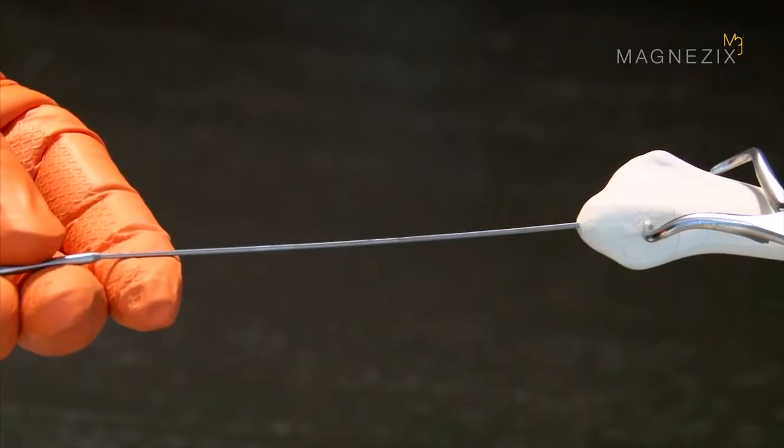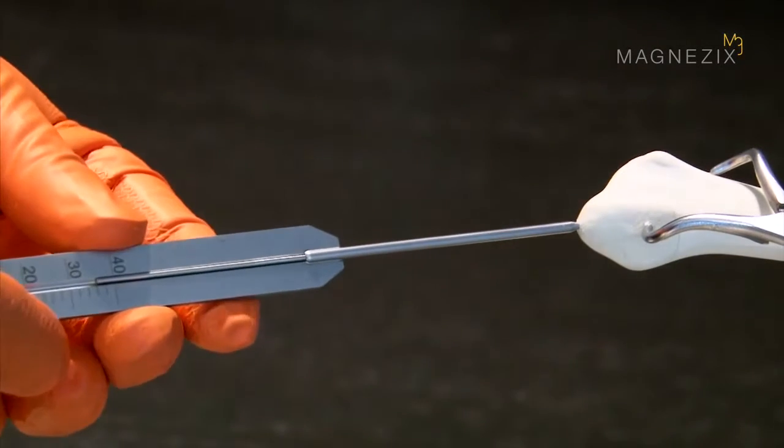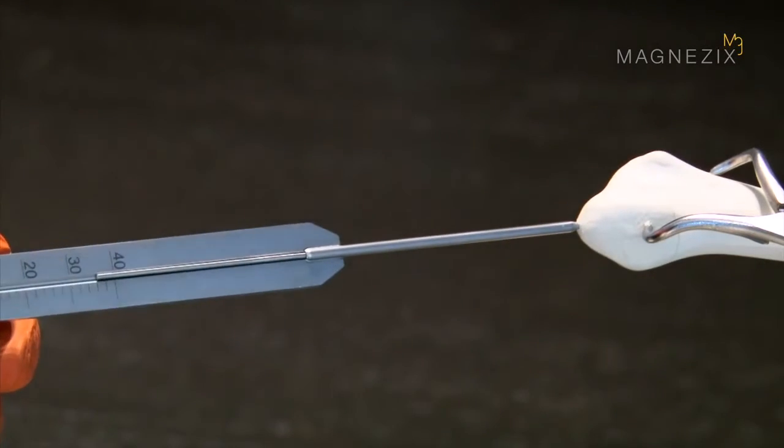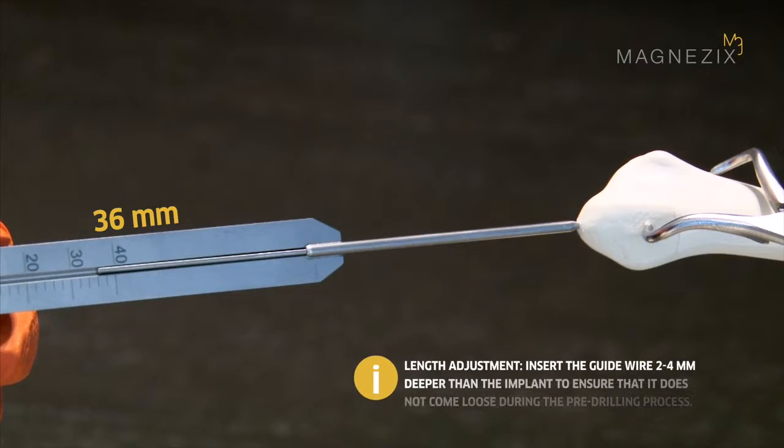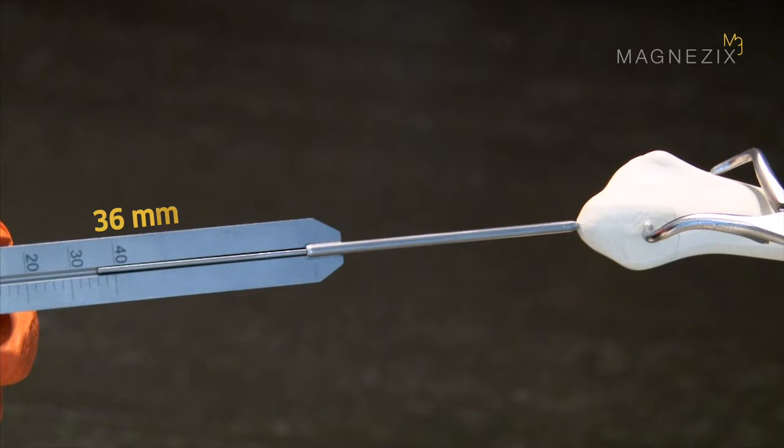Use the associated measuring device to determine the length of the 3.2 compression screw. In our case, the length is 36 millimeters. At least 2 millimeters must be subtracted from the measured length to ensure that the guide wire does not detach from the bone during the subsequent pre-drilling process. In this case, we will therefore use a 3.2 compression screw with a length of 34 millimeters.